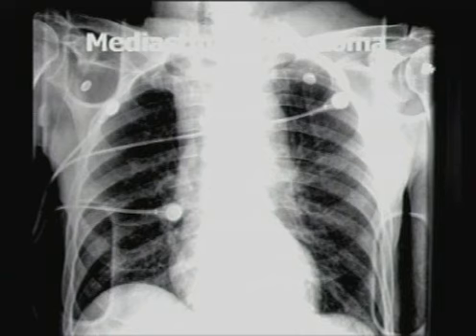This was a bit of a frightening case when I was a fellow, just about to leave for vacation, and I was doing the night shift, so I had nobody else there. The gentleman showed up with this radiograph, which obviously I found very concerning. We have all of the features that concern us. We've lost our aortic contour, we've shifted our trachea, we've thickened our right paratracheal stripe. Our left paraspinal line, wherever it is, probably extending up and maybe forming a small apical cap.